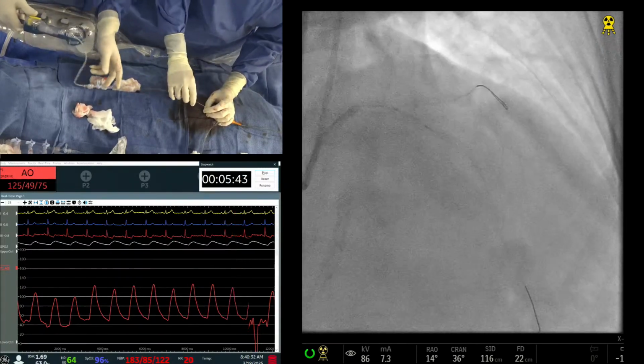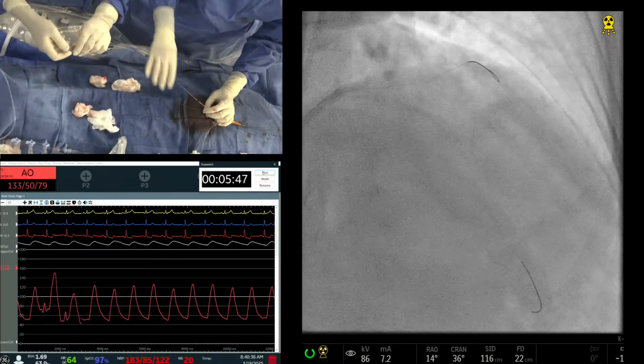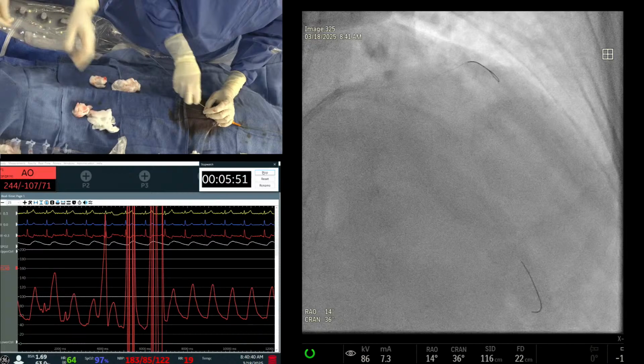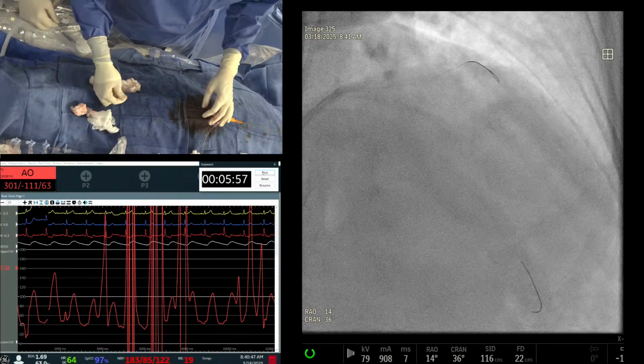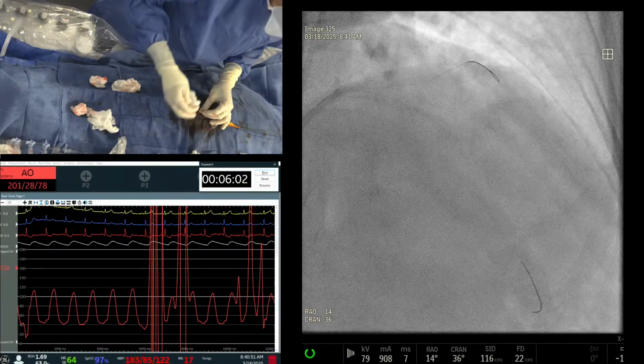The balloon ruptured. Now at the ostial proximal LAD, is there a nodule? Non-compliant now. The nodule is just in the left main. Nothing in the LAD. The LAD has a calcium plate, ostium to mid portion. Yes, of the left main. Okay. Now we go with the non-compliant balloon, which we had earlier.